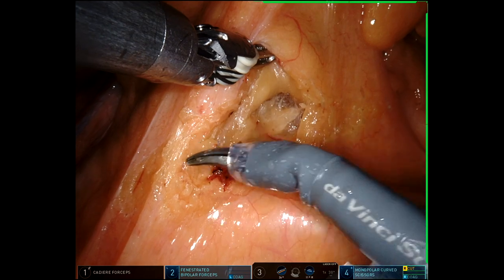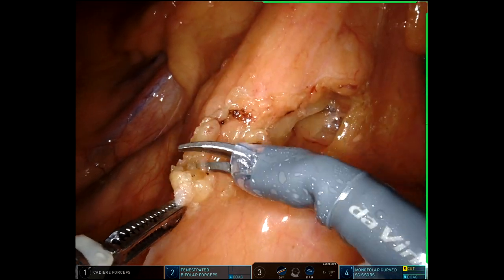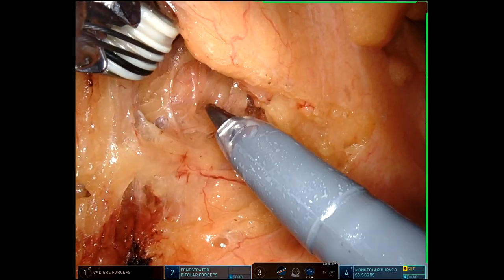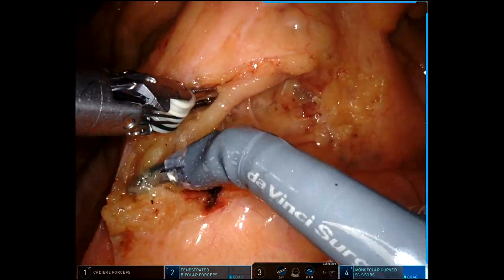Favorable body habitus in this patient made for a more easy surgery, particularly compared to a lot of the diverticulitis cases I've been doing lately. And we'll just work our way underneath the IMA pedicle here, sweeping the nerves posteriorly, and then coming up along the IMA pedicle back to the aorta.